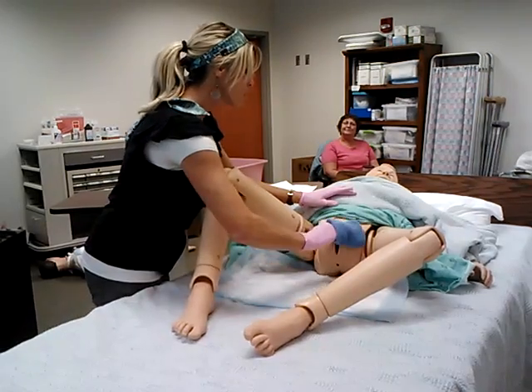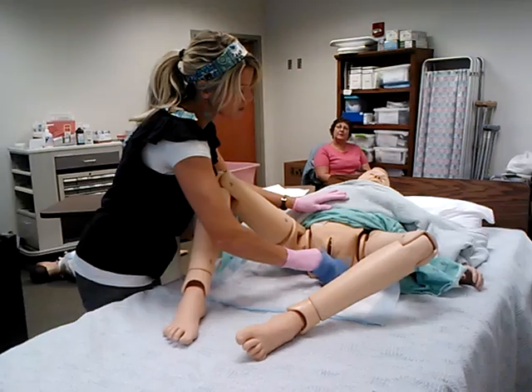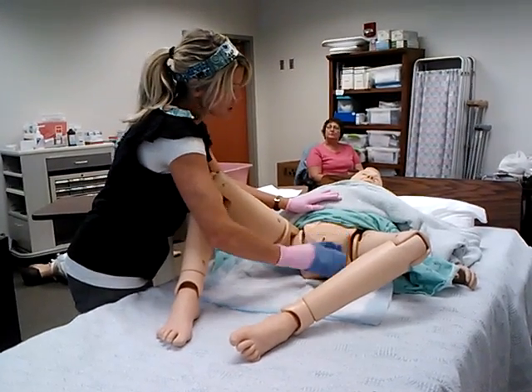And just let her know what you're doing. We're just cleaning you up really good down here so that you don't get an infection from your catheter.